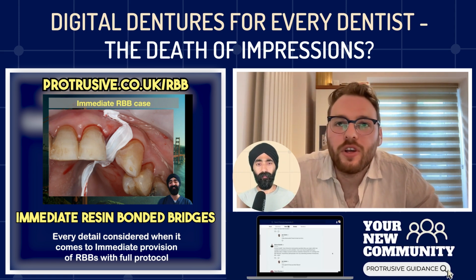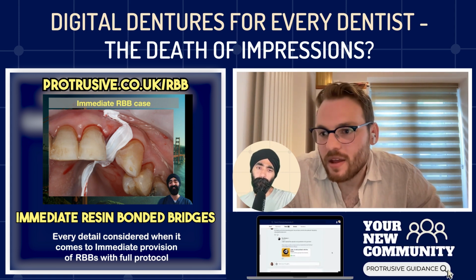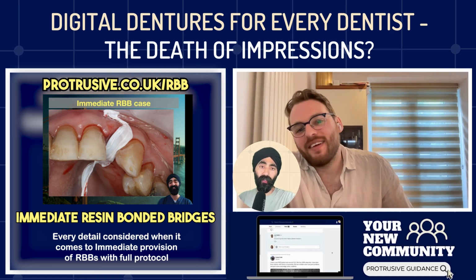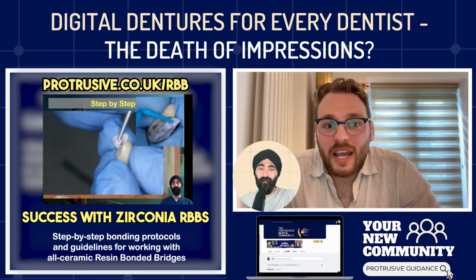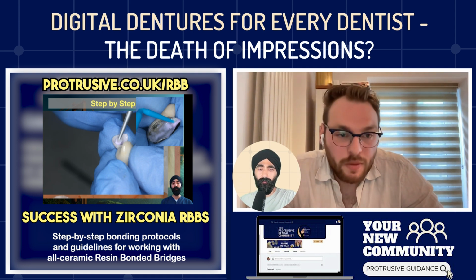Sure. So if you're looking at a bounded chrome, upper bounded chrome, something like that, then my workflow, let's say it would be replacing upper lateral to upper lateral and then a molar on one side. Cool, fine. So I'd be scanning as a primary. So scan, usually for me that would be in the consultation.